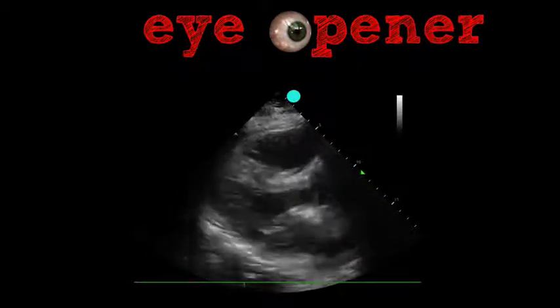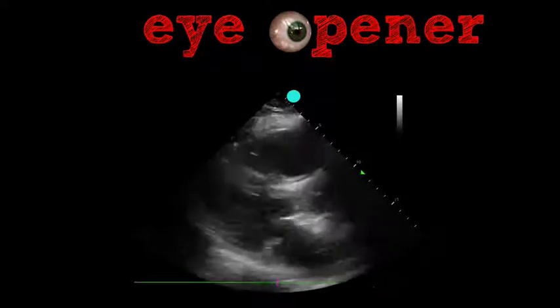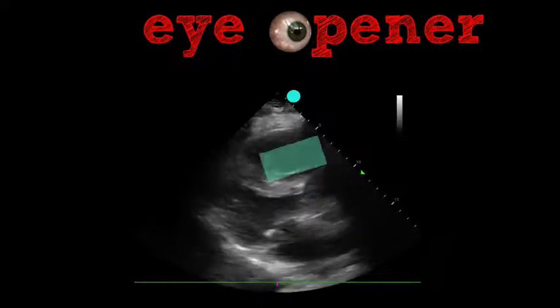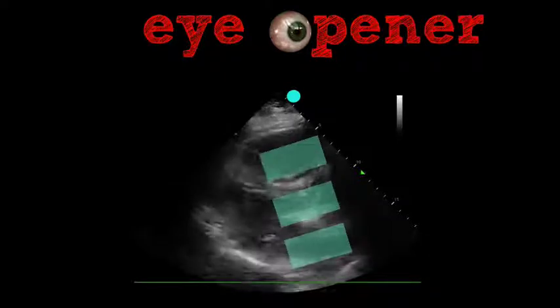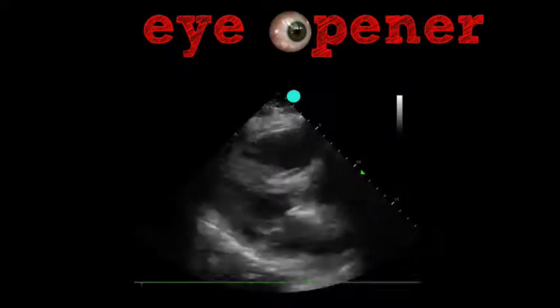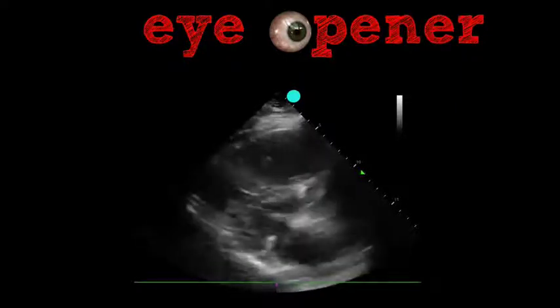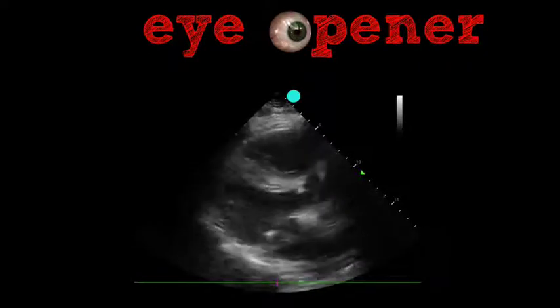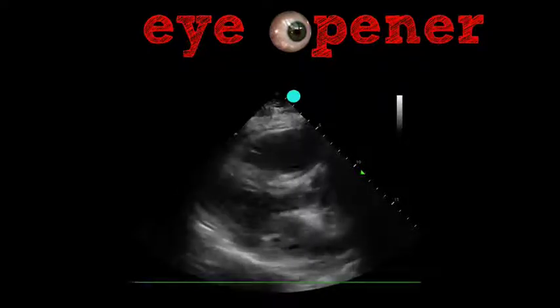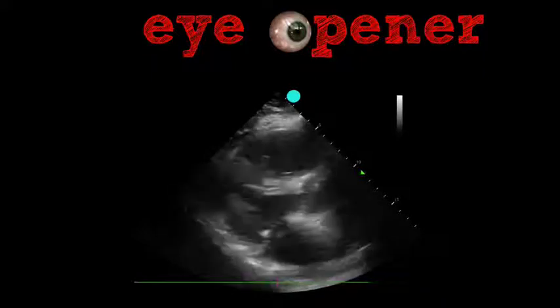We can see here that the right ventricle in this parasternal long axis view looks to be a bit dilated. If we think about our rule of threes, the RV, the LV outflow tract, as well as the left atrium, all should be lined up and relatively the same size, but we're seeing here that one of those things, the RV, looks quite big. We also notice the LV might look a little underfilled with some possible paradoxical septal motion there along the septum, but we'll get a little better look at that when we move into the short axis.